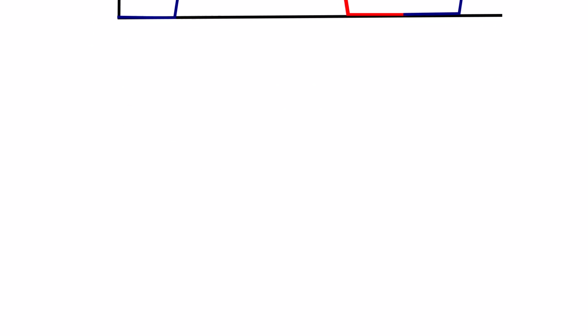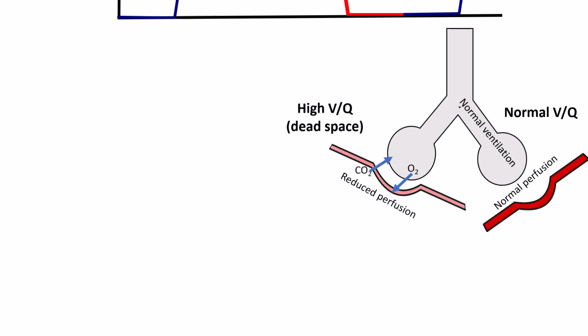There are several conditions that cause an increase in the arterial to end-tidal CO2 difference, indicating a rise in physiological dead space. Dead space gas comes from parts of the lungs where ventilation occurs without effective perfusion, meaning little or no CO2 is exchanged.